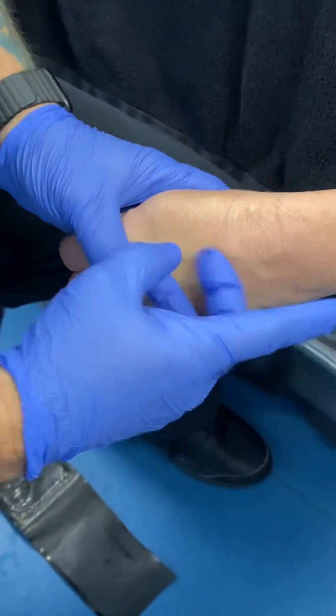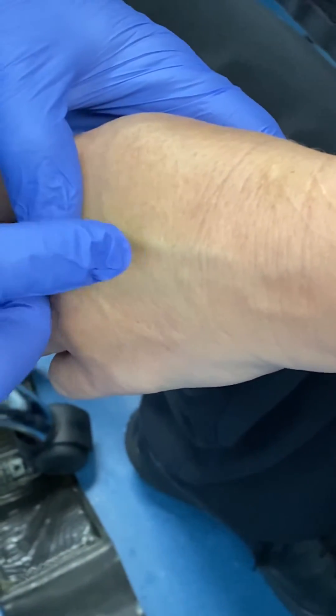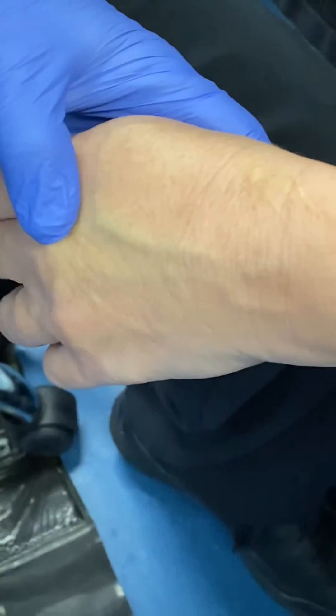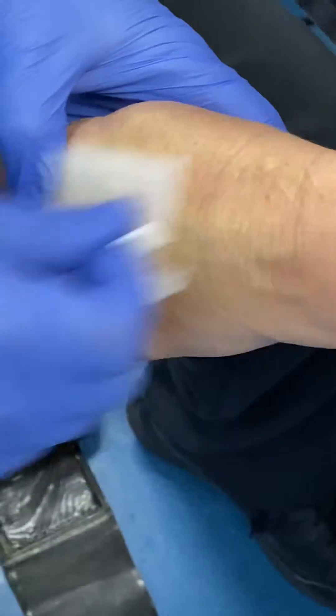As you can see, she's got a really nice vein here on the dorsum of her hand. I'm just going to go right down here at about a 30-degree angle. Here we go — a little alcohol to the skin. Boom, just like that.